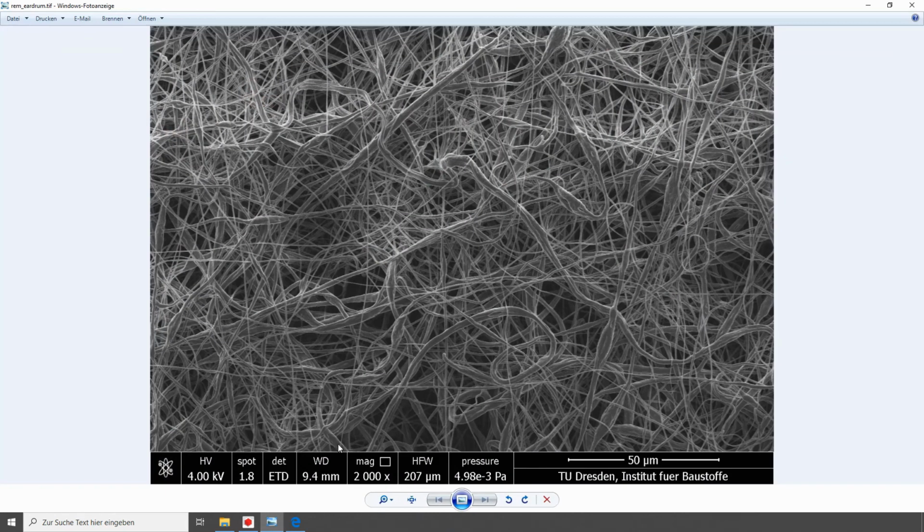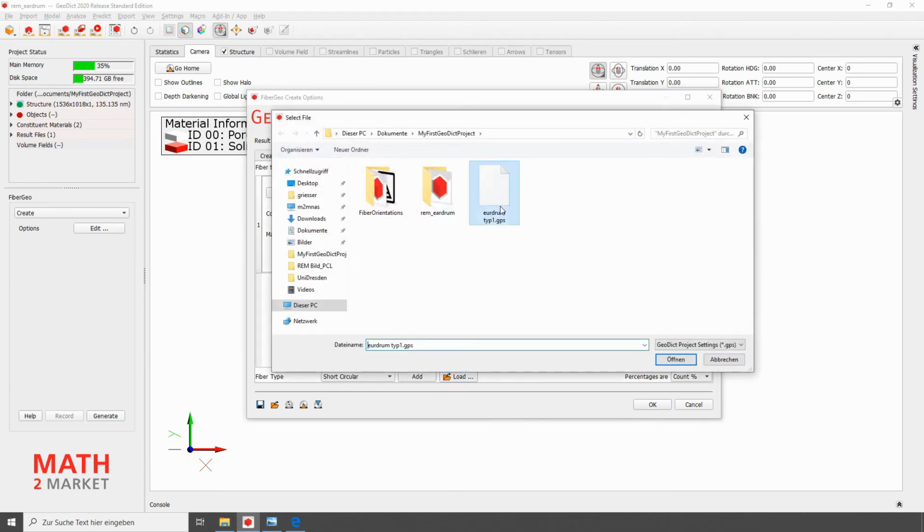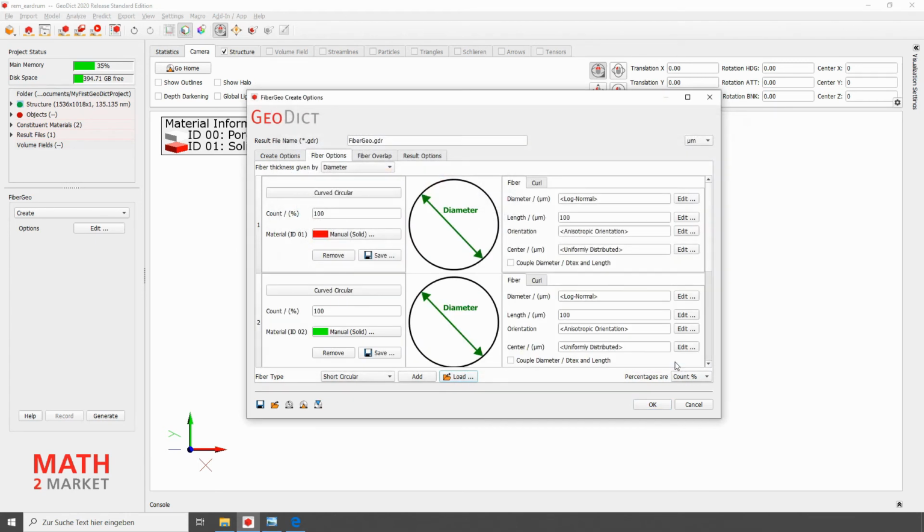If we take a closer look at the SEM picture again, we can see that there are many fibers that are very straight, so we would like to model these too. For this, we could add the type curved circular again and enter all parameters again. But since we only want to change the curvature parameters, we simply reload the type we just saved. This way we can get a copy of the Eardrum Type 1 fiber.